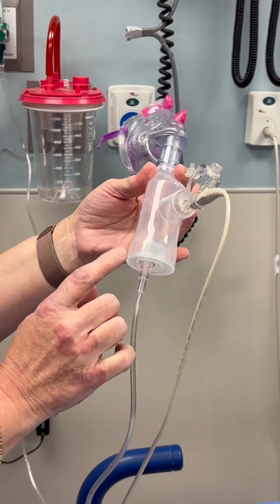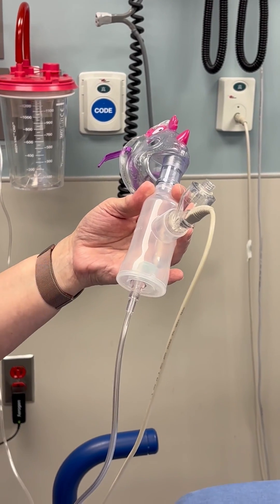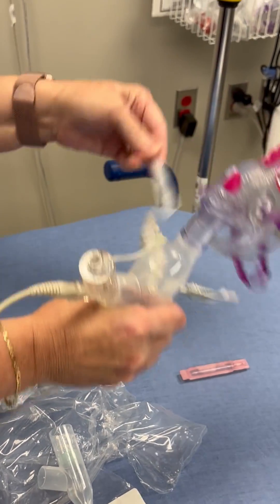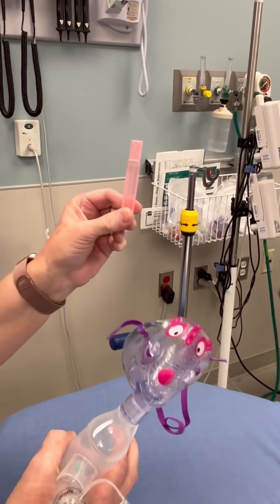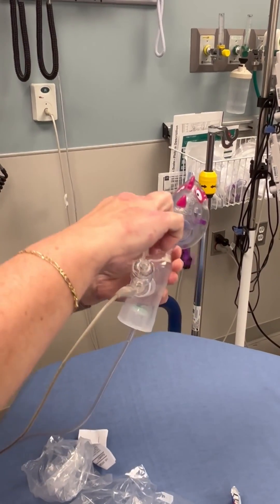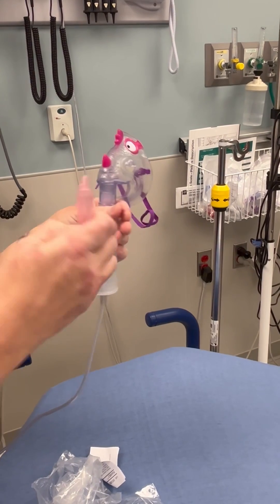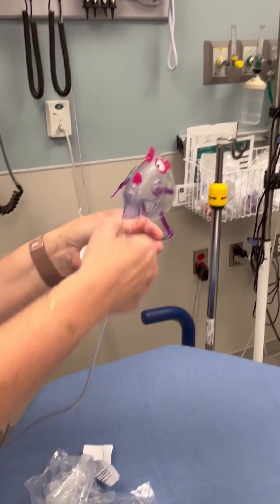The 0.5 to 1 liter flow rate is just going to help push it along a little better for a child that doesn't have a great inspiratory effort. Now the racemic epinephrine is concentrated. When you open this up, you're going to see it's just a small amount in there, so you have to dilute this racemic epinephrine with some normal saline. We're just going to pour that right into the little chamber. This has 5 mL — you only need to put 3 mL in. And then close it up.